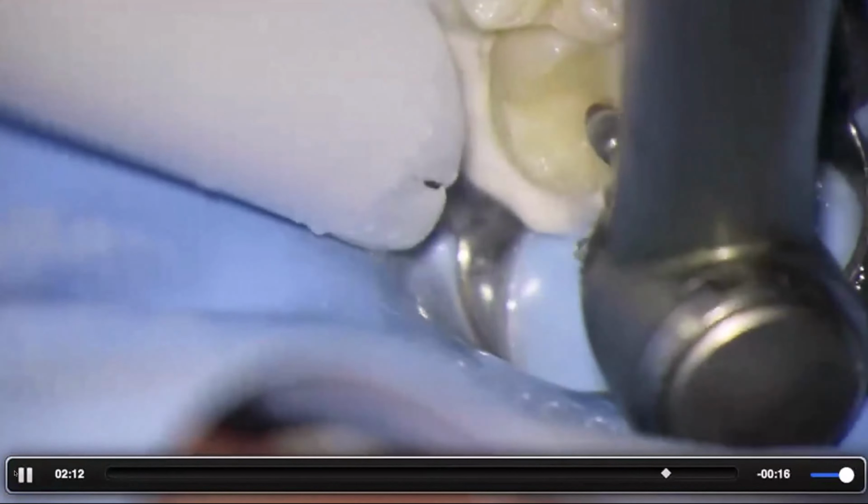Polymerization. And then, if you do this right, oftentimes you don't have to do much occlusal adjustment, if you build up these cusps and grooves and anatomical components properly. You oftentimes don't have to adjust them. So here I'm just smoothing it off.